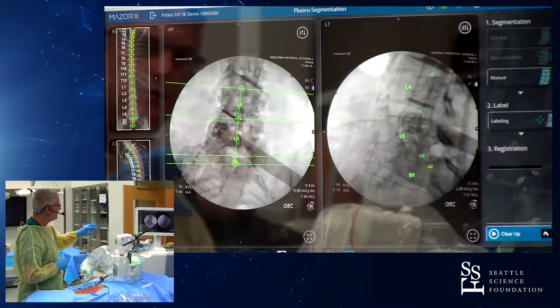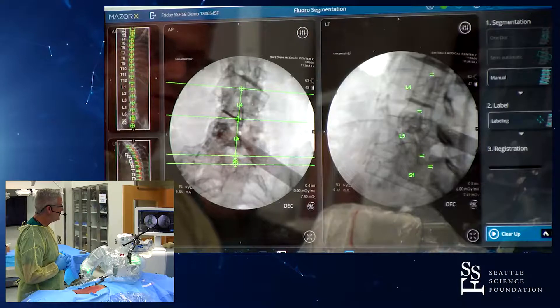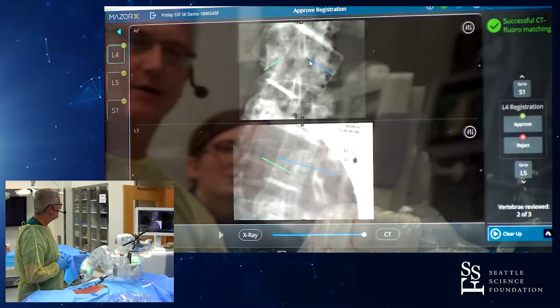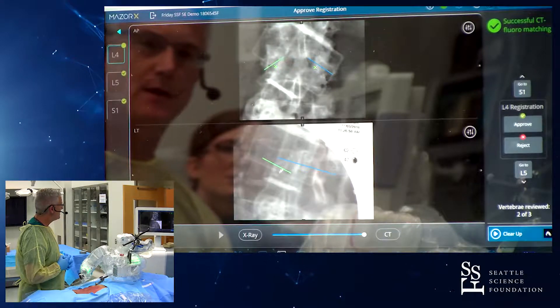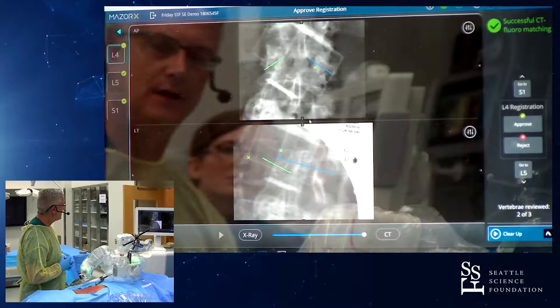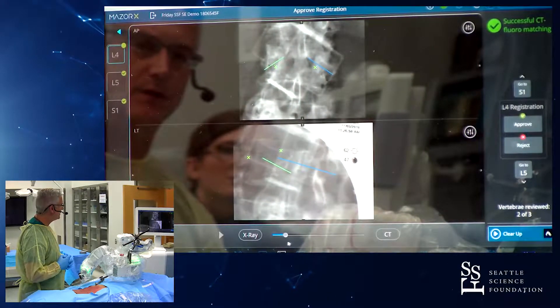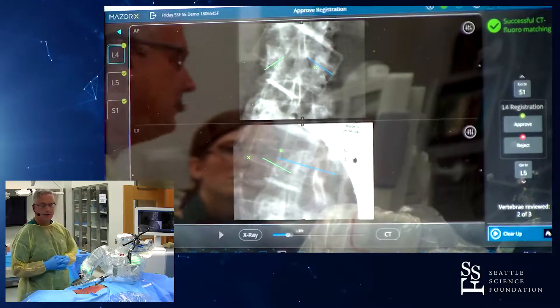On the old machine — as this is the new one — we can go ahead and proceed. We'll define our medial pedicles here, the anterior aspect of the body in the end plate, and then we'll evaluate our merge between the CT and fluoro.